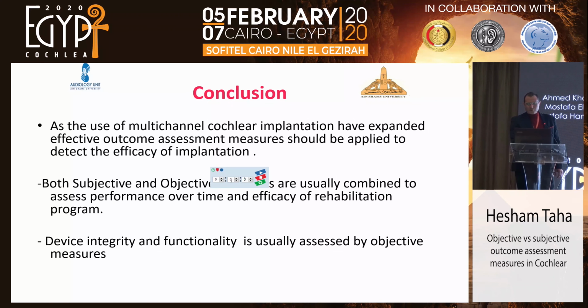Okay, device integrity and functionality is usually assessed by objective outcome measures.